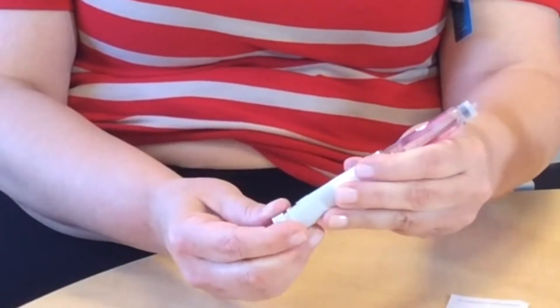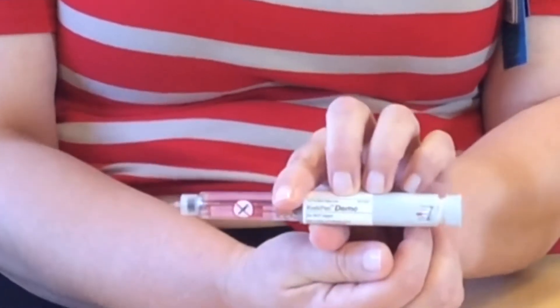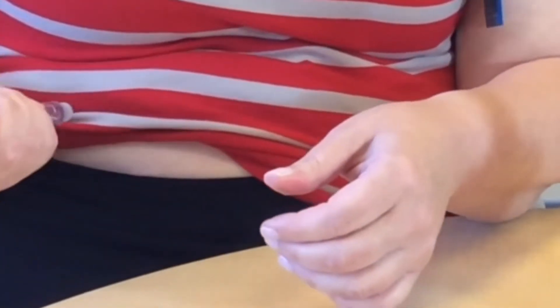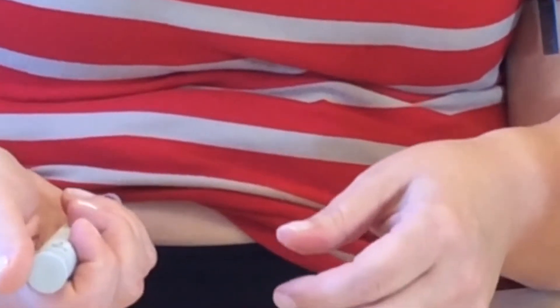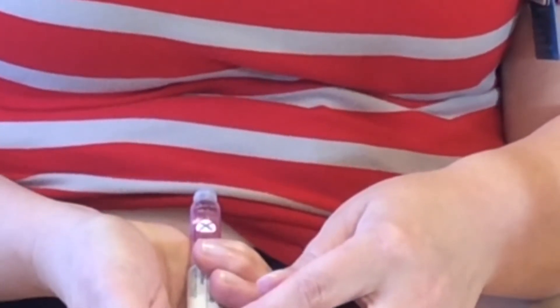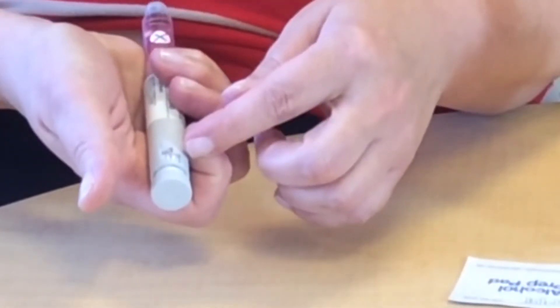Now I'm going to dial up my dose, which I'm going to use three units. I'm going to insert the needle into my injection site at a 90-degree angle — what's called straight in — and then push the dose knob all the way in. I'm holding it so I can see the dose window, and I'm going to watch and make sure that it goes to zero. Then I'm going to count to ten.